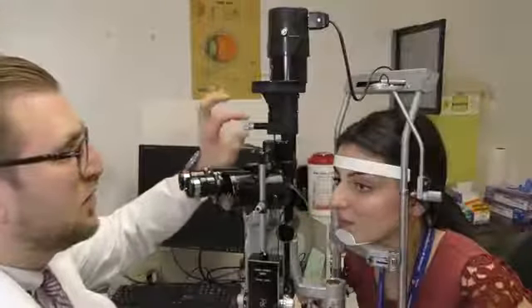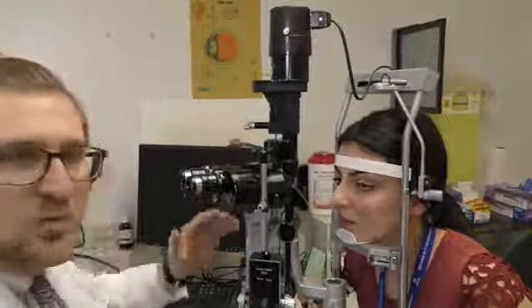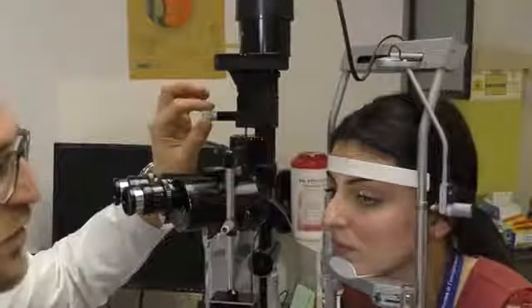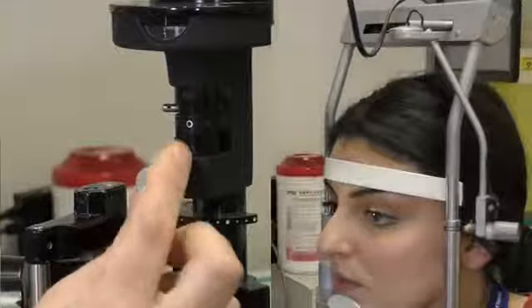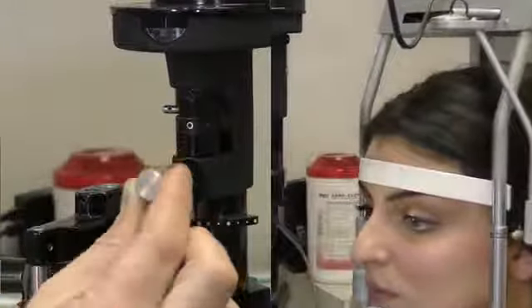Next knob that you want to be familiar with is this one here. Okay, so we know how to make the beam wider and more narrow. Now, how do we change the height of the beam? Well, we use this one here. So what I do is I turn it clockwise, okay? And what it does is it will make the beam go either lower, shorter, or higher, okay?